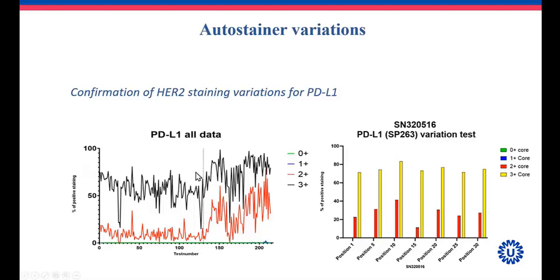Essentially, we got the same results. On the left, you see the variation over time. You see that for the 3+, there is some variation. For the 2+, there is some variation. And even for those 0 and the 1+, you see these lines here. There's little variation, but probably this variation where the 2+ and the 3+ are within the same range, almost from this moment onwards. And that's unacceptable. This is the experiment repeated for PD-L1 with the different slide positions.